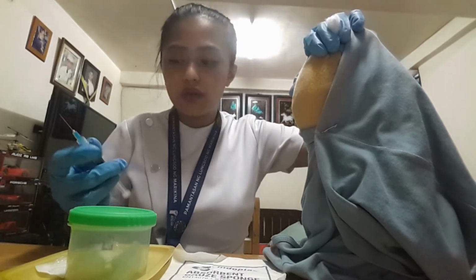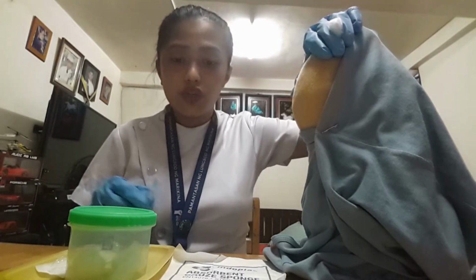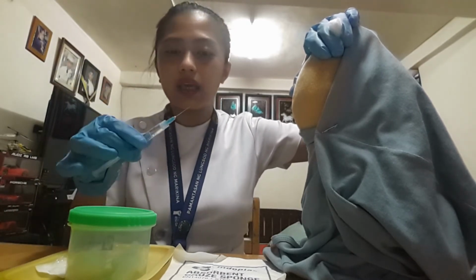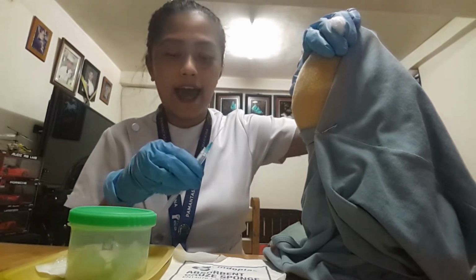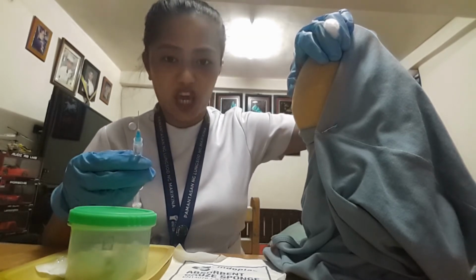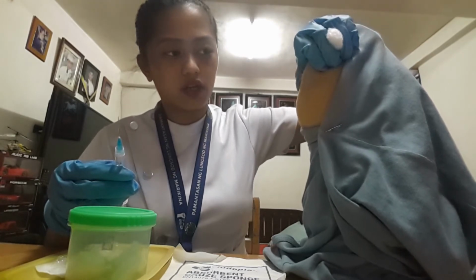So now I will be injecting the medication. First, I have to grasp the syringe with my dominant hand, which is the right hand, between my thumb and fingers. Okay, just like that. The next is I need to place my non-dominant hand on the arm of the patient and pinch the site where I will be injecting the medication. So I need to pinch.